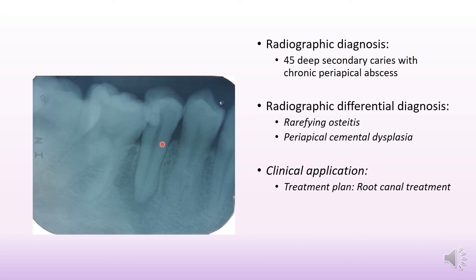This leads us to the diagnosis: the radiolucency and the caries together lead to a diagnosis of 45 having deep secondary caries with chronic periapical abscess.